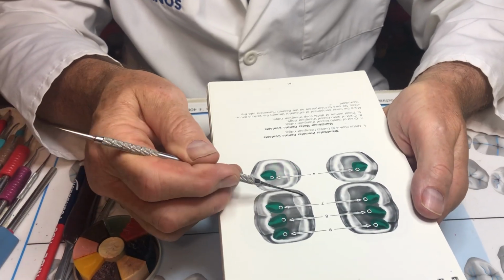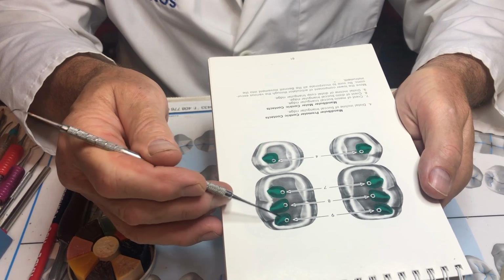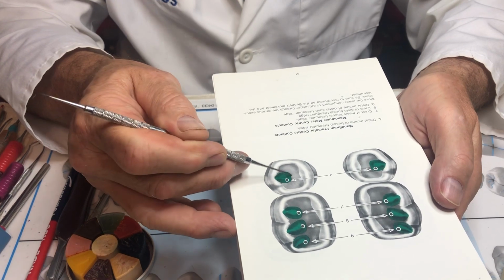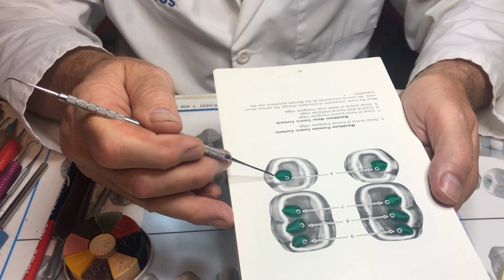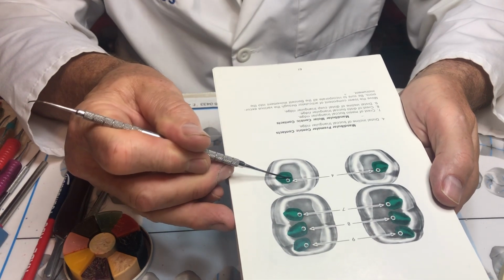We've already done the entire outline in various colors. Now we're going to move into the triangular ridges. So before we start anything, let's stop and look at them. They have a general triangular shape. They are wider down in the center. They're narrow in the top. I find most students, for some reason, are doing them upside down. They're making them wider here and narrow in the center.